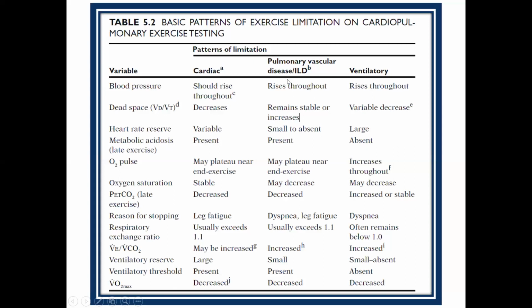Now, to differentiate between pulmonary vascular disease and ILD just needs a chest CT. I mean, when you're looking at CPET, you're basically just looking at patterns. You're not getting down to the minute diagnosis. You're trying to give a pattern.